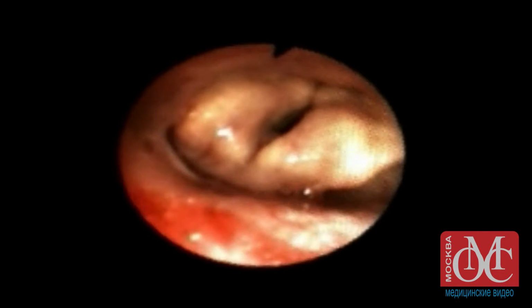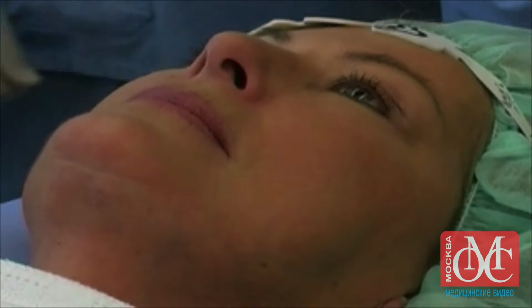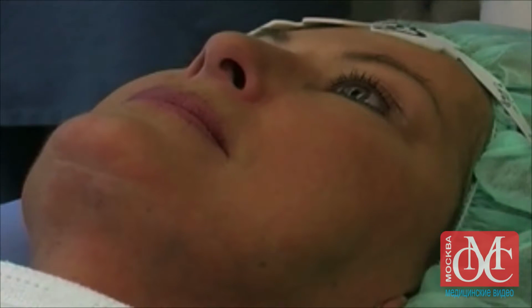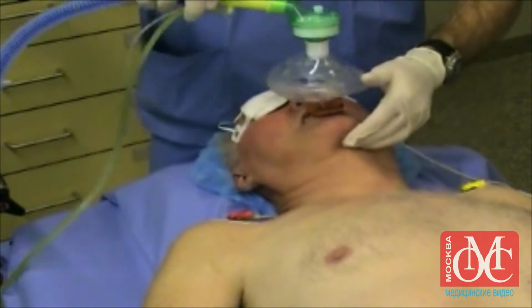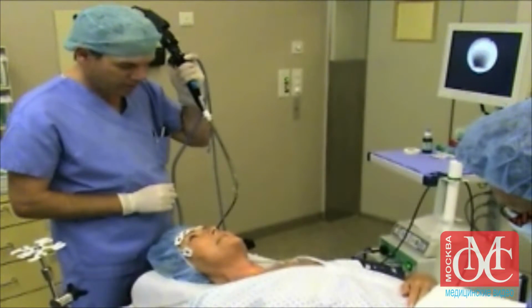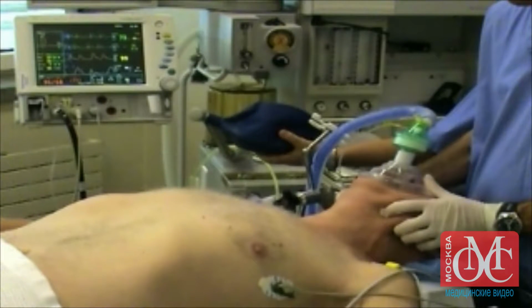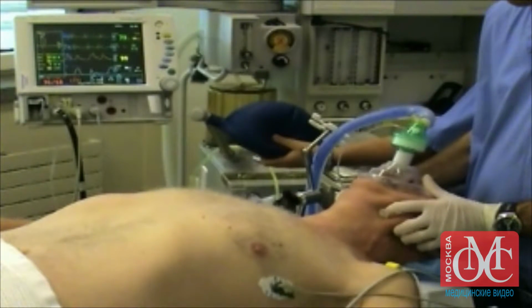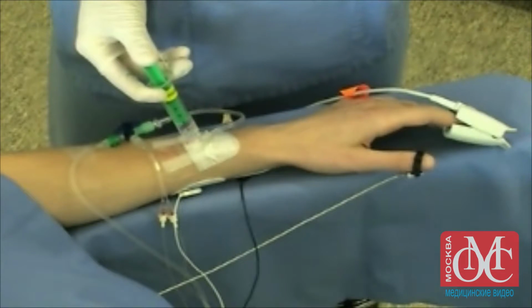Fiberoptic intubation plays an important part in the management of a difficult airway and is recommended by many societies of anesthesia. It is primarily important for the management of the anticipated difficult airway, but can also be used to secure the airway in an unexpected situation. There are different techniques for both situations, the nasal and oral approach in the awake and anesthetized status respectively. The choice of the equipment and medication is primarily dependent on personal preference.